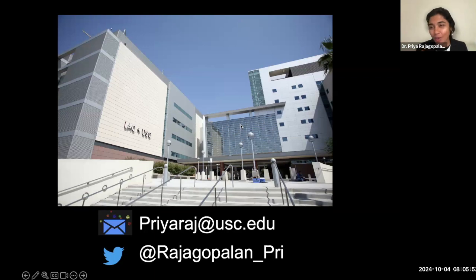So to come back to your question, on a spotter case, I hope your examiner is kind enough to show you a kidney cancer right next to it. But other than that, I don't think it's very, very clear cut. I would say maybe more enhancement, more hemorrhage and necrosis point more towards renal cell carcinoma, and then a little renal cell cancer on the side, or the fast growth. These are the things I would think of.